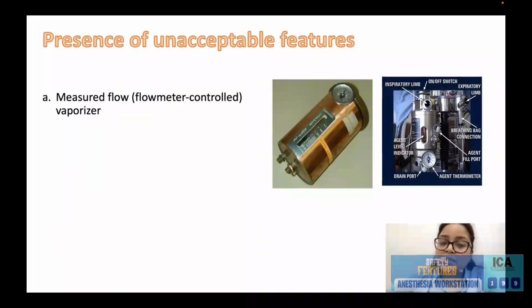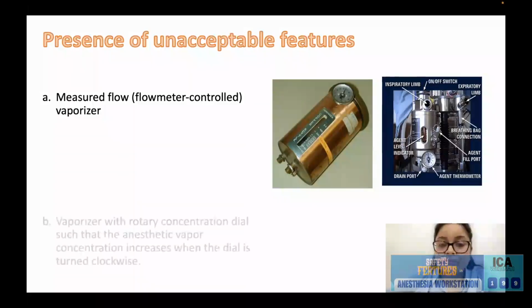Many anesthesia providers are not sufficiently familiar with them to use them correctly, and it may result in delivery of inadequately low or dangerously high anesthetic vapor concentration. And some of these vaporizers also lack the side fill features needed to prevent accidental overfilling and spilling of the liquid anesthetic into the breathing circuit.